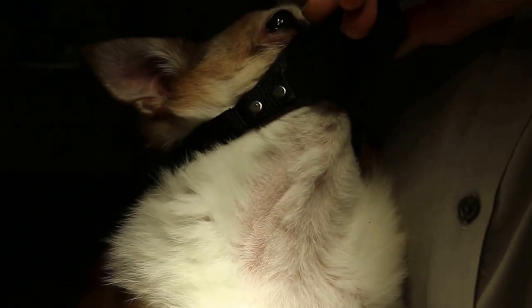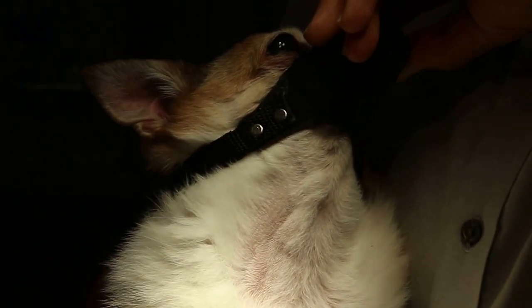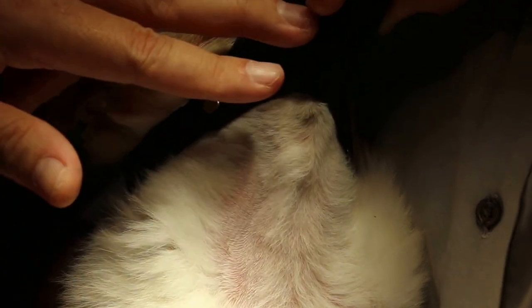What's the date today? August 13, 2015. Taking blood from a jugular vein — the assistant holds the dog quite close to his chest. There's a muzzle on for those quiet dogs.